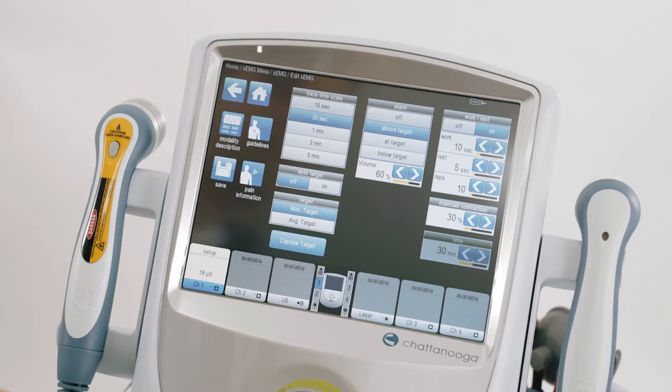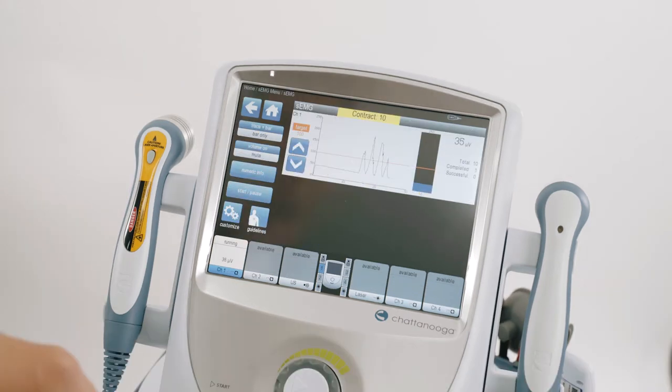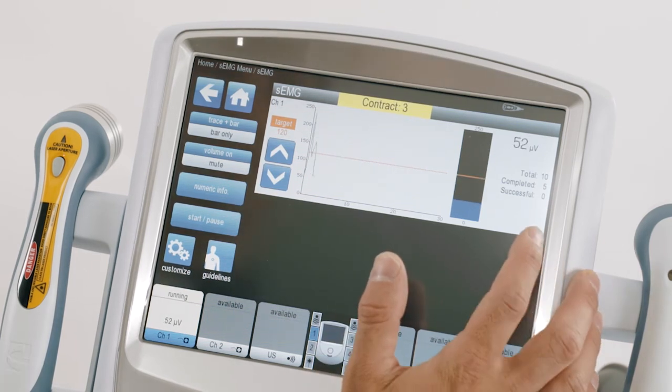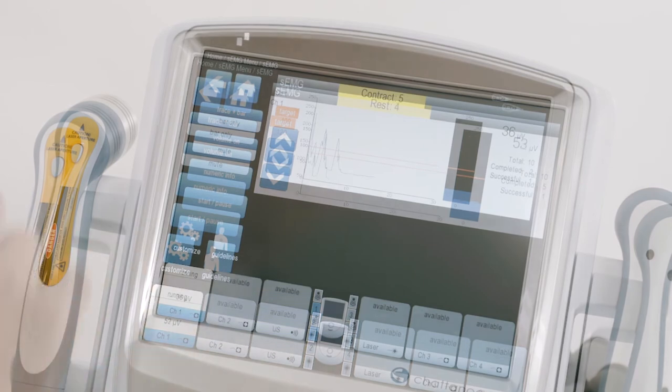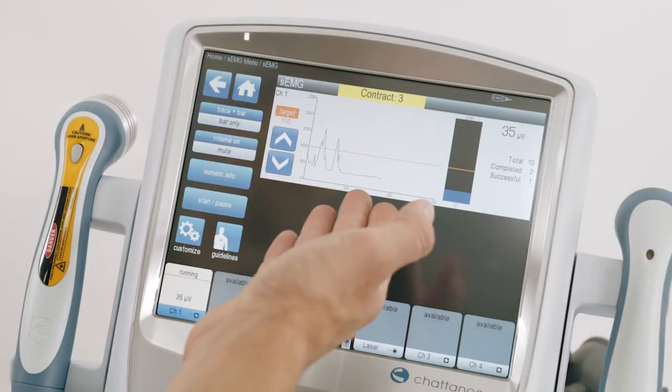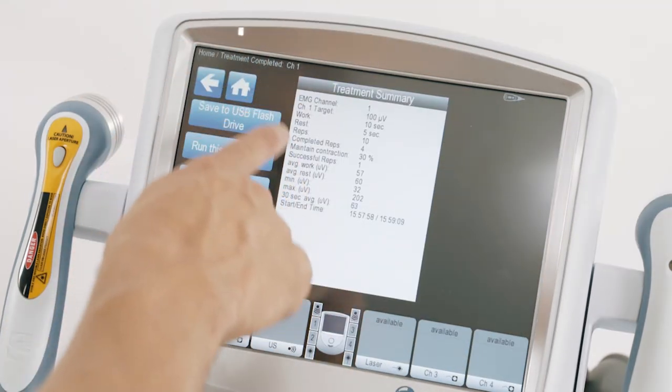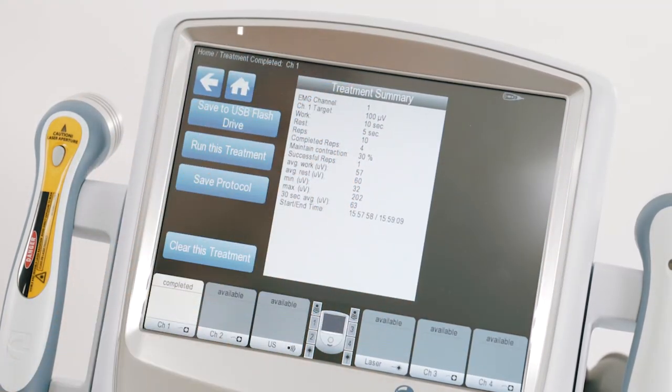To start the treatment, press start. The machine will prompt the patient to contract. In this example, the patient was able to maintain their contraction for 30% of the time and therefore reached a successful rep. At the end of the treatment you'll receive a treatment summary.